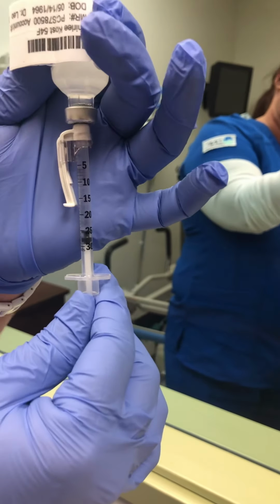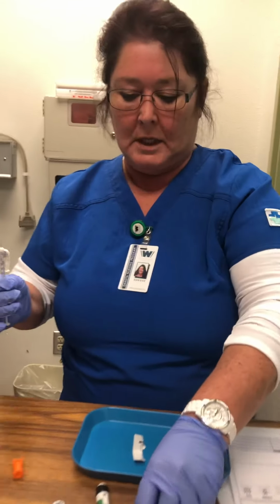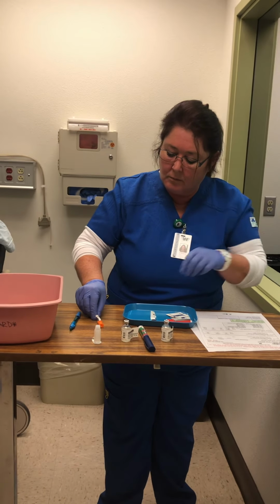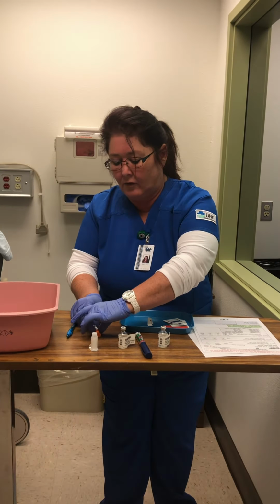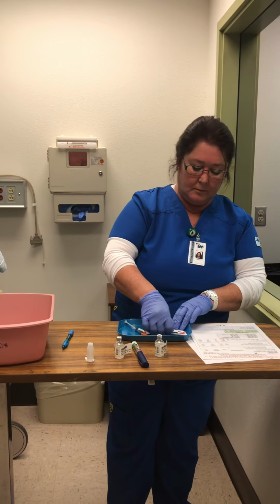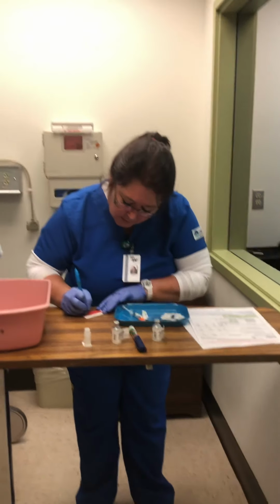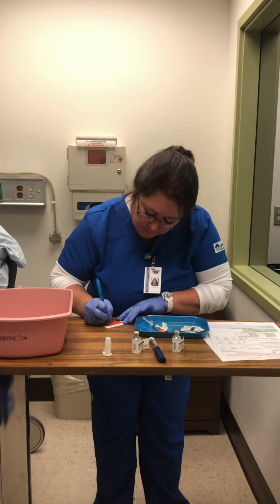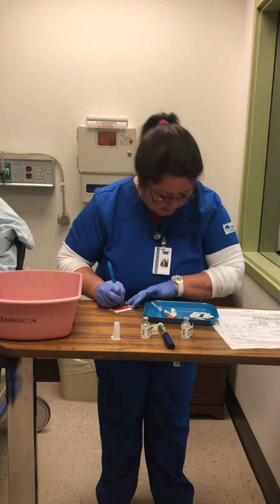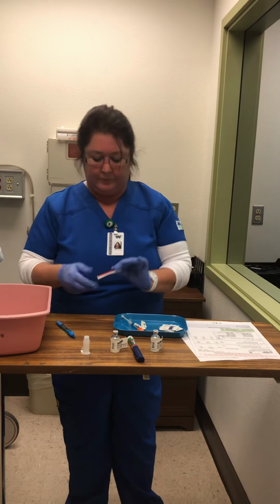I'm going to have my other nurse verify. Verified. And I am now going to recap with the scoop technique, making sure that I grab it on the sides. And I'm going to label my needle. I've got my regular with 10 units, and I've got my NPH with 15 units, my initials, and I've got the date, and I've got the time as 5:20. So we are still good.